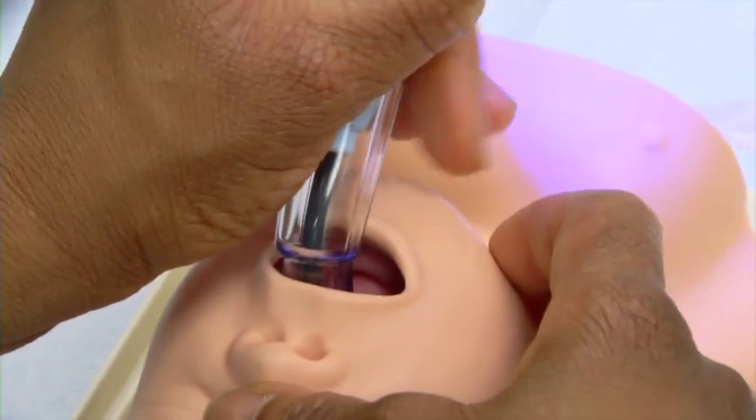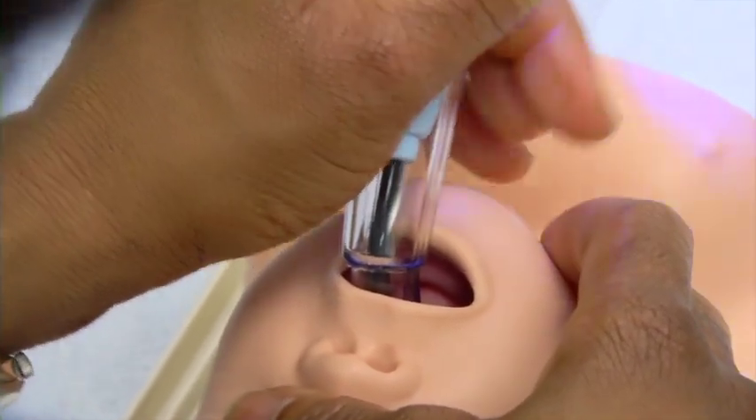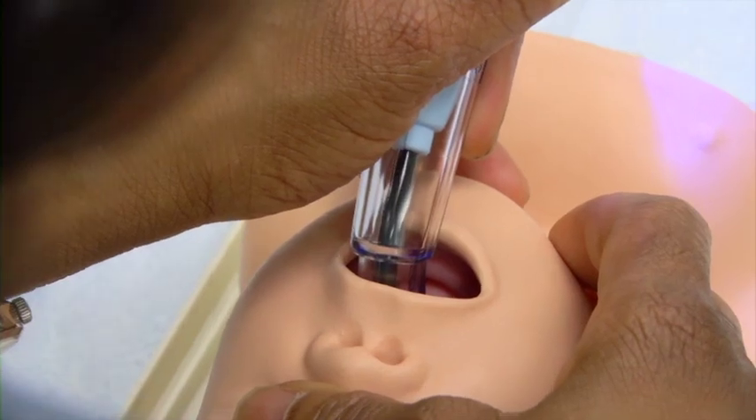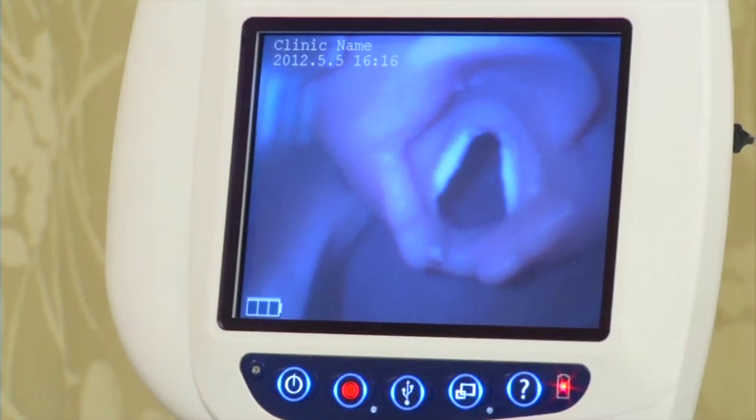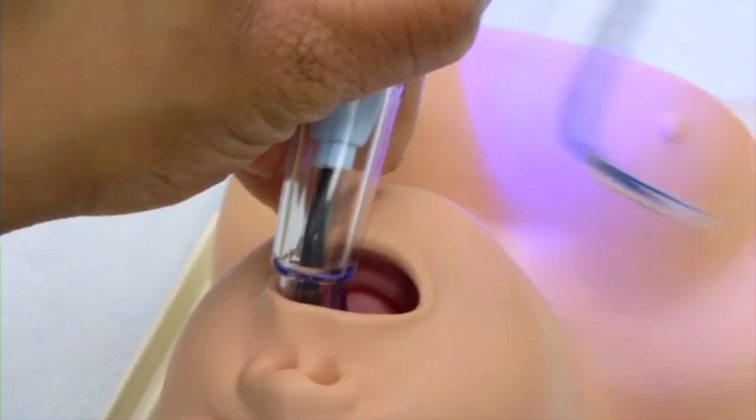When the mouth opening is actually very small and the working space is limited, you might want to move your blade over to the left slightly, giving you more space to introduce your endotracheal tube.